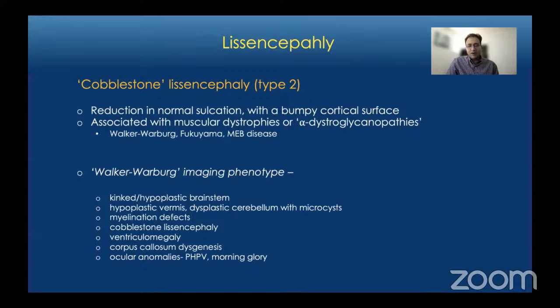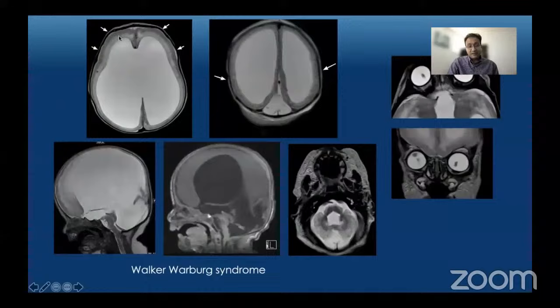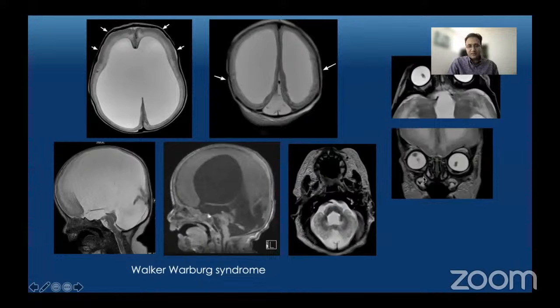In this patient we have diffuse paucity of sulci in both cerebral hemispheres with smooth-appearing gyri showing a lobular morphology, characteristic of cobblestone lissencephaly, best seen in the parietooccipital regions. There is associated marked ventriculomegaly and a characteristic kinked brainstem with cerebellar hypoplasia. There may be mild cystic changes in the cerebellum. This patient also has ocular abnormalities in the form of persistent hyperplastic primary vitreous. This constellation — cobblestone lissencephaly, callosal dysgenesis, ventriculomegaly, kinked brainstem, hypoplastic cerebellum, and ocular anomalies — is the Walker-Warburg phenotype.